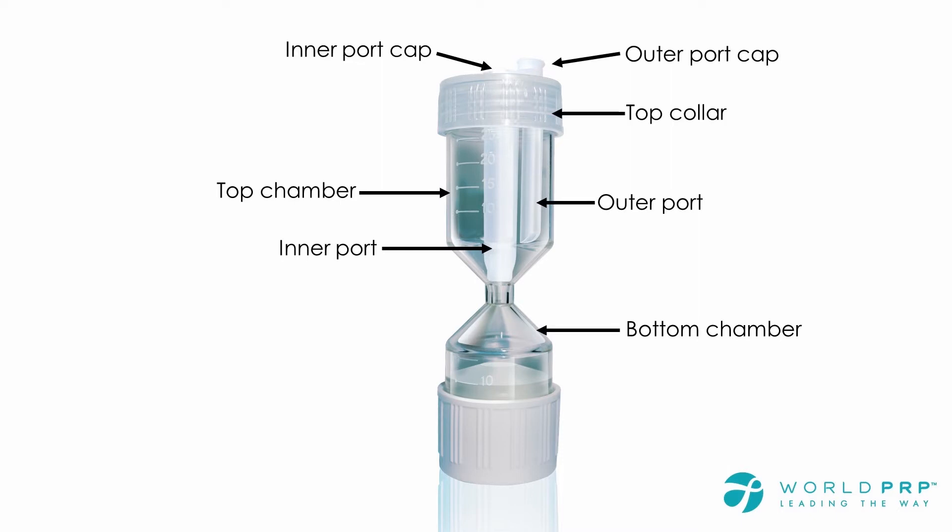The top collar is used for turning either counterclockwise or clockwise to open or seal the connection between the top chamber and the bottom chamber. After centrifugation the red blood cells are separated into the bottom chamber with the buffy coat on the surface. The bottom collar is used for gently turning counterclockwise moving the inner piston up, pushing the buffy coat into the neck of the device and then into the top chamber.